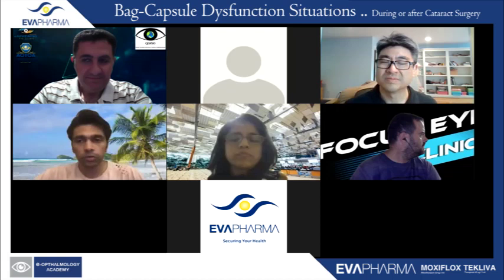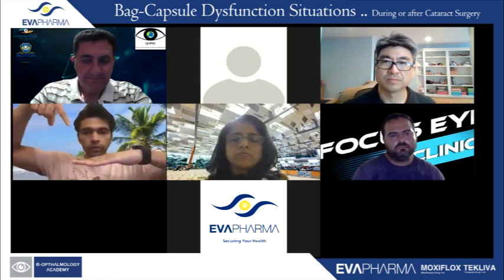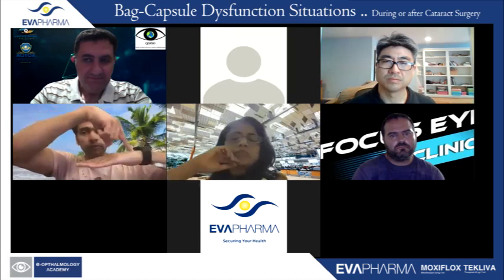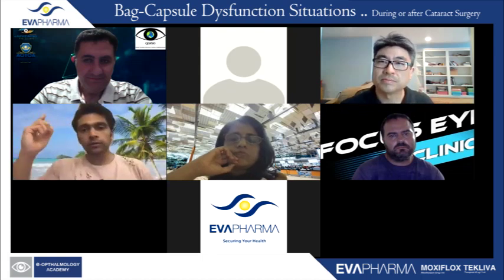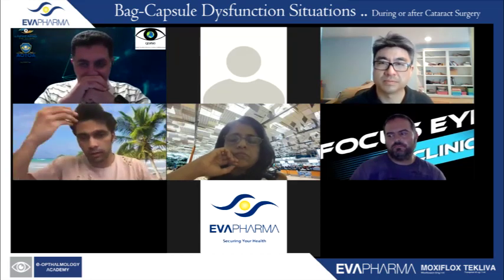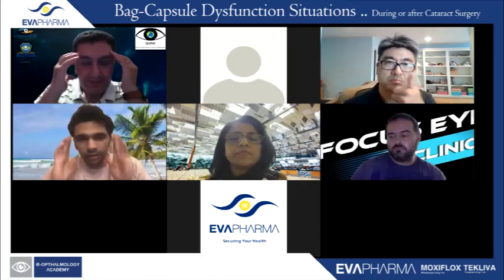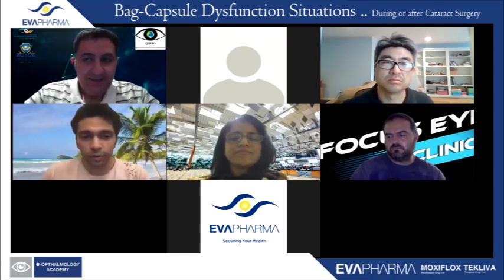Yeah, it's a good point actually. If this is the IOL and you're going in from the right side, try not to grab it on the right side. Grab it on the left, because the minute you supinate your hand, you'll actually hit the iris. If you supinate your hand like this, you're going to hit the iris, the vacuum breaks, and the IOL goes down again. So the only small tip is probably hold it towards the opposite side. It's easier to just watch it online and know, for the viewers.